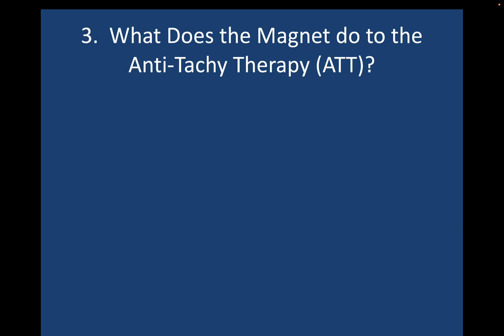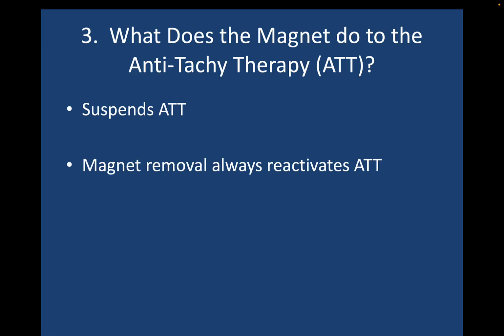Now, concept number 3 is a little more straightforward. What does the magnet do to the anti-tachytherapy? This is quite straightforward, in fact. It suspends the anti-tachytherapy. No matter what device you have, assuming that it's programmed to respond to the magnet, the anti-tachytherapy will be inhibited for as long as the magnet is on the ICD. If you remove the magnet, then the anti-tachytherapy will always be reactivated.